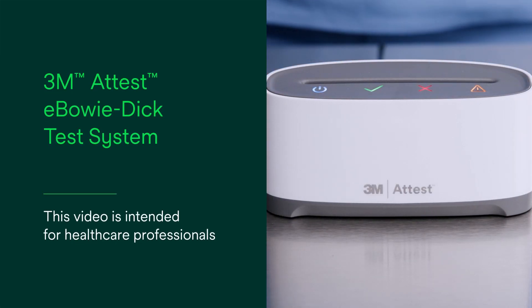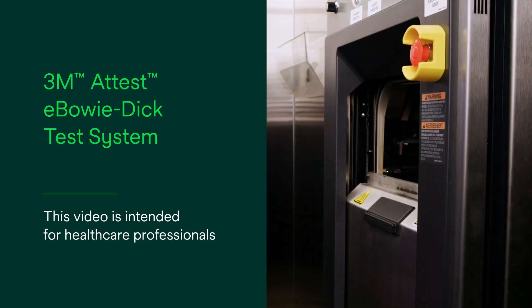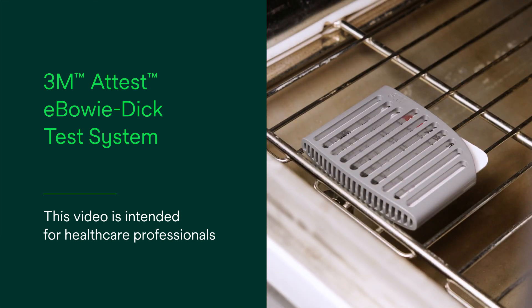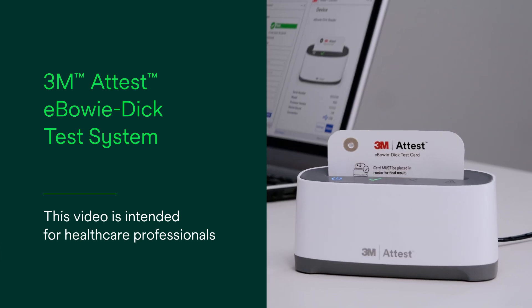This video will help you simplify, standardize, and streamline your sterilization process using your 3M ATest eBowieDIC test system, the first of its kind automated digital sterilization testing system.